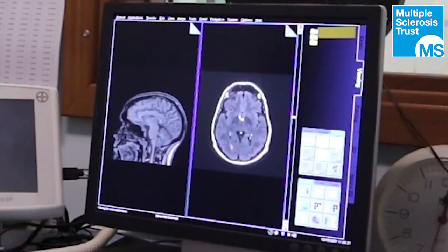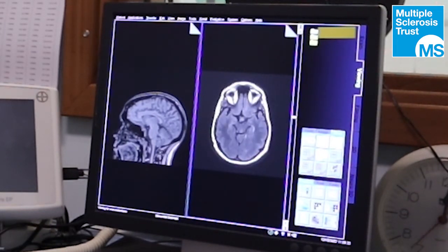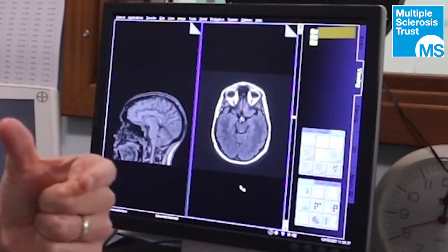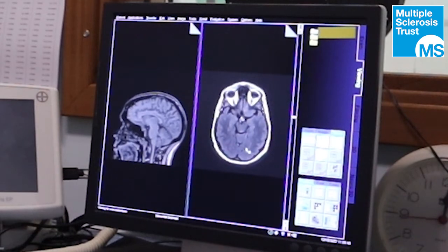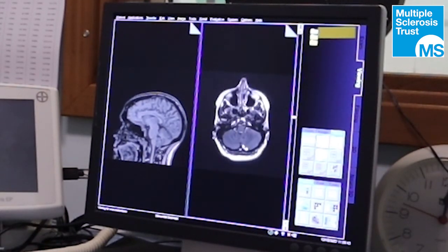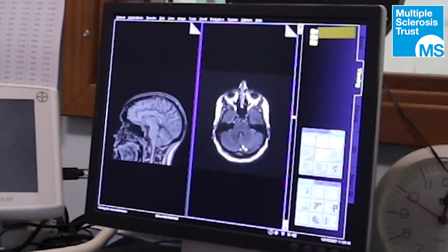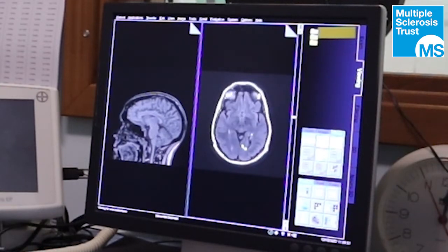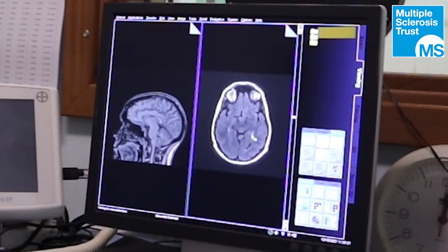On standard NHS-strength scanners, a T2 will pick up just over 60% of lesions and a FLAIR will pick up just over 70%. This is a FLAIR on this side — these are the eyes, so the patient is looking upwards. At the bottom of the brain we work our way upwards, and what we're looking for in a FLAIR are little white lesions that would suggest MS — not specific for MS, but in keeping with it. For example, here and here.